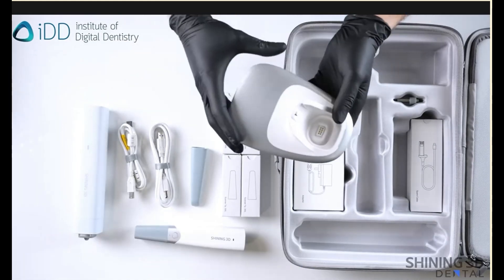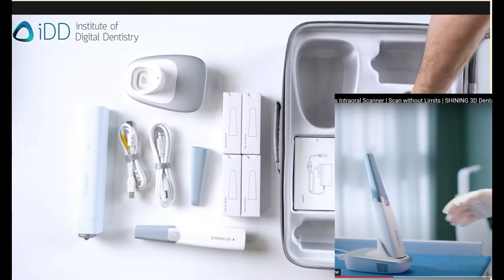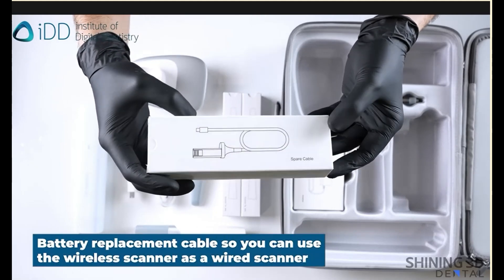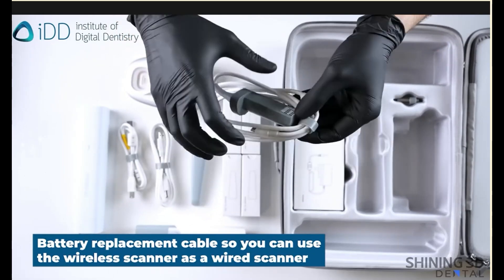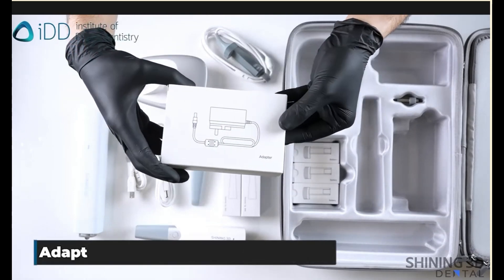Next we have the charging cradle, which is a charging stand for the scanner wand. The battery backup cable is handy in case you run out of battery power, and allows you to work with a wired power supply. This is the DC power supply.